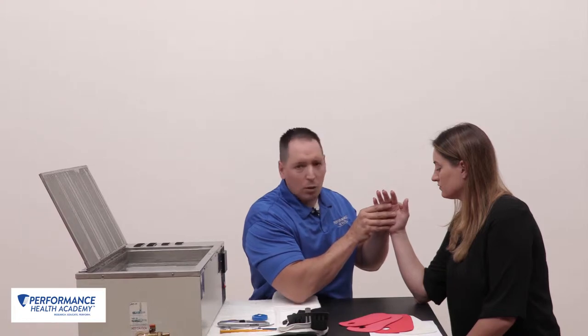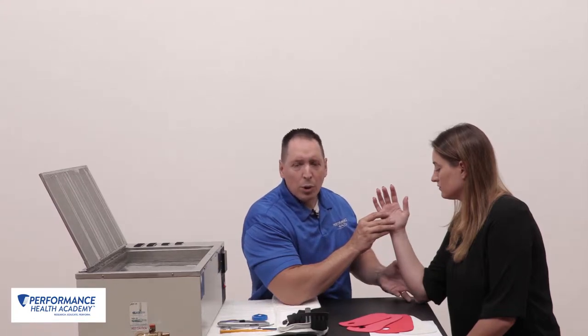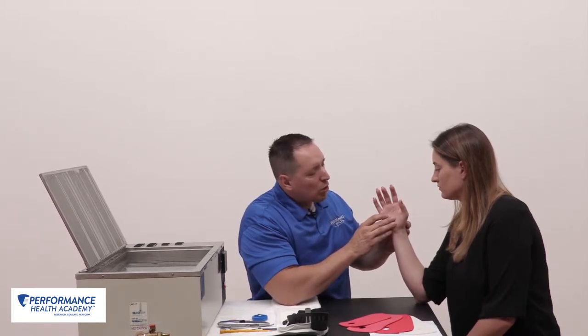Whether I want a little bit of wrist extension, neutral, a little more flexion or ulnar deviation — position the patient where you want them first, whether you use an elevator, a pillow, a towel. Also, make sure when you have your splint station set up, you're face to face with the patient so they can see exactly what's going on.